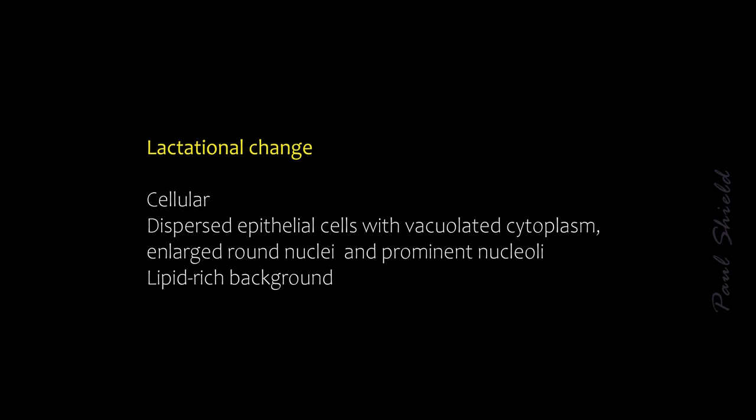Background material is quite helpful. It's usually lipid-rich, which looks like clear bubbles on the Giemsa, but sort of proteinaceous material often on the PAPs. And obviously clinical history is quite crucial in identifying that. So this again can be a cause of false positive diagnoses because of that dispersion and the enlarged nuclei, but it is a well-known trap, and so it's important to correlate clinically.